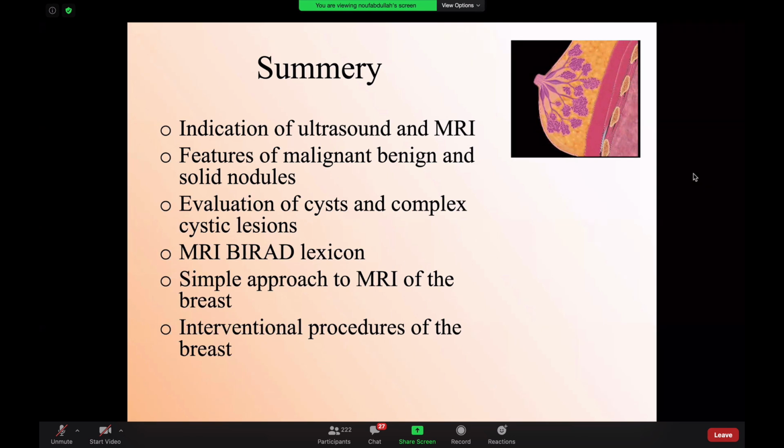you will put the patient on the stereotactic table and then you will move the tube one time to the right and one time to the left. The X-ray projection is sometimes 15 plus on the right side and 15 minus on the other side. The intersection between the two X-ray projections will give you the X, Y, and Z measurements for the location of the microcalcification.